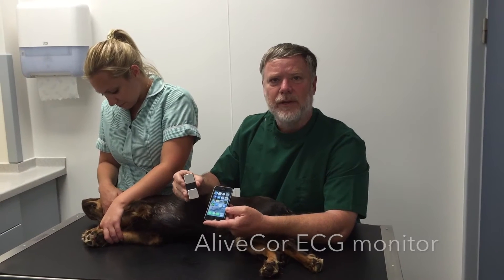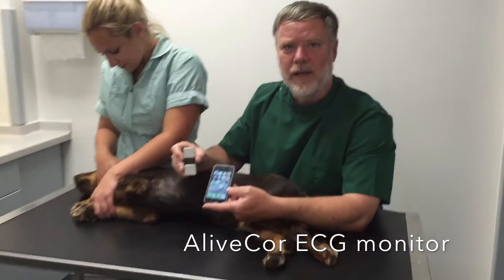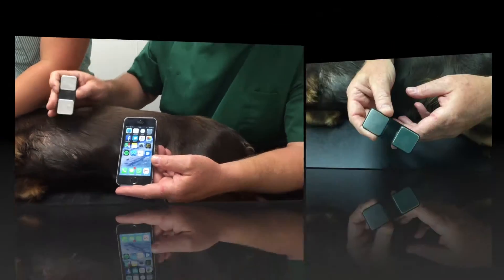I want to show you how to use the AliveCore ECG Heart Monitor. This is a quick, cost-effective, and easy way to record an ECG in your pet.